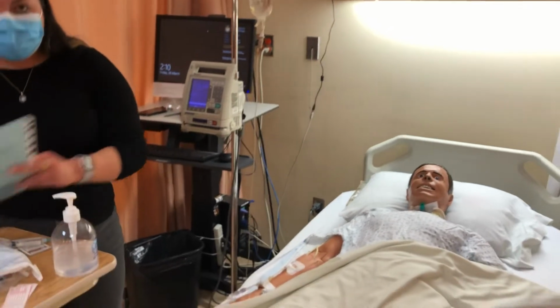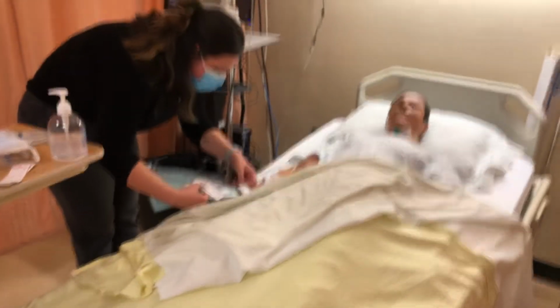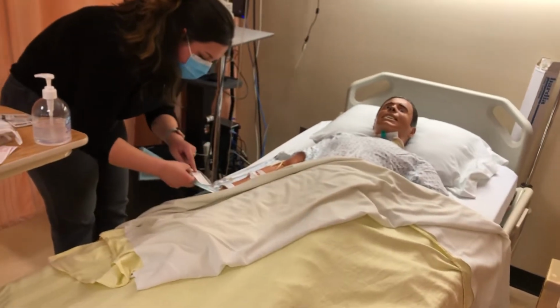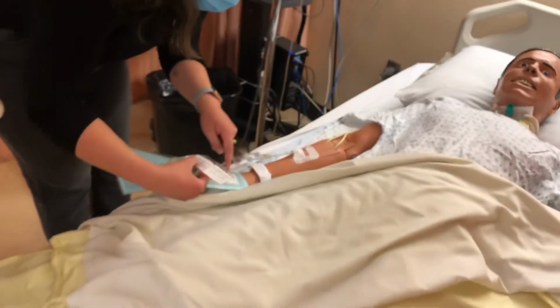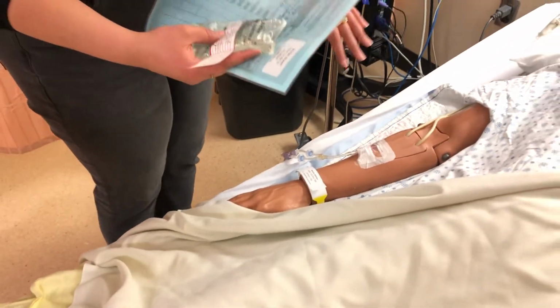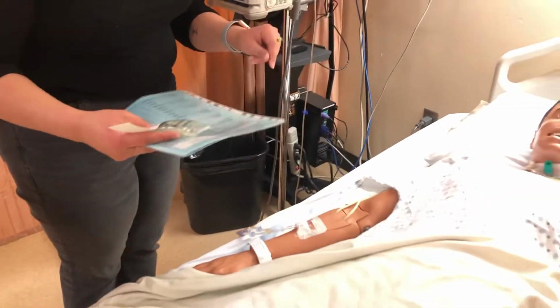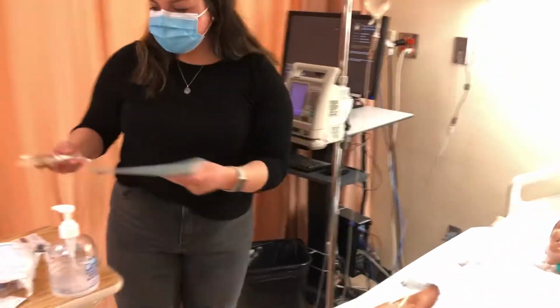So I'm going to complete my third check. So here we have Bryson Scotland. I have that on my tag as well. This is the patient number, 1, 2, 3, 4, 5, 6, 7, 8, 9, and I have the same on my label. Can you tell me your name? Good, and what's your birthday? Great. And Bryson, do you have any allergies? No? Okay, that's excellent.